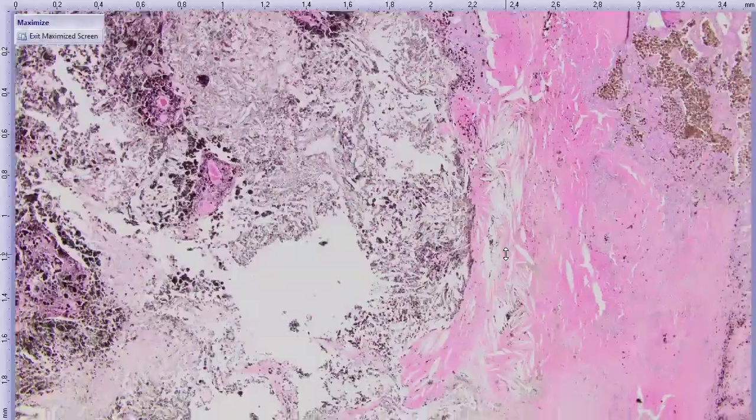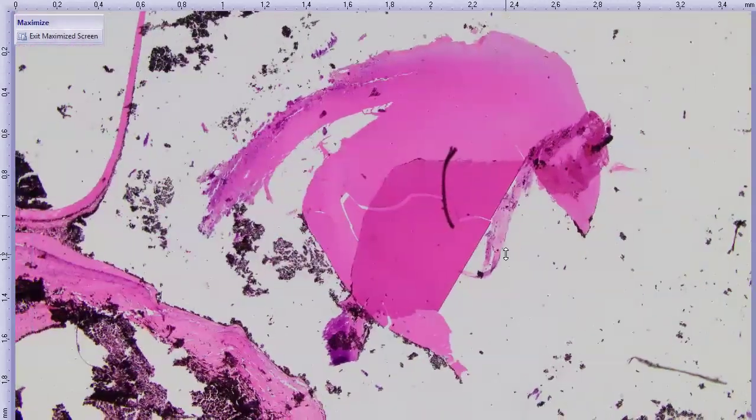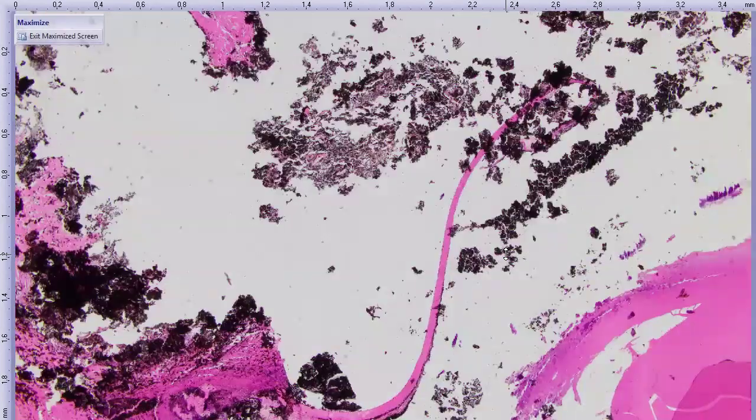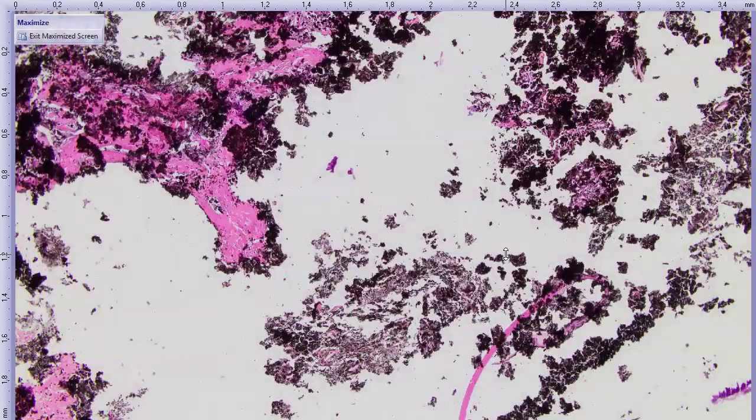And there's a lens capsule rupture. I showed you a little piece of lens nucleus here. There's some lens capsule floating around. So potentially some trauma associated with this tumor. We don't know. But one thing that we decided to do was a PAS stain.